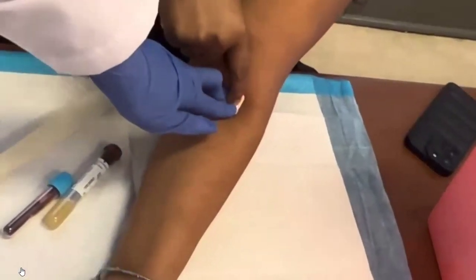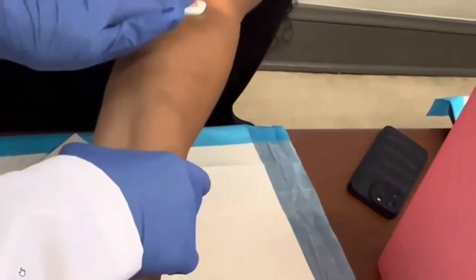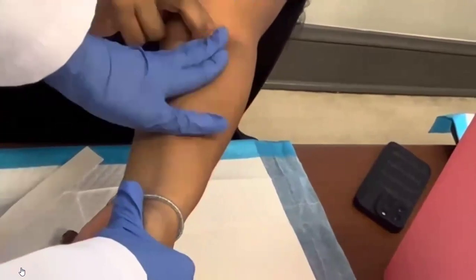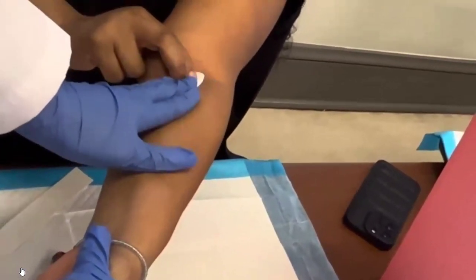Now, can you apply pressure for a moment? Sure. I'm going to have you kind of lift your arm up and apply pressure. Now, while your patient is applying pressure, because you want to continue to apply pressure and allow it to stop bleeding before you apply the Band-Aid, right?